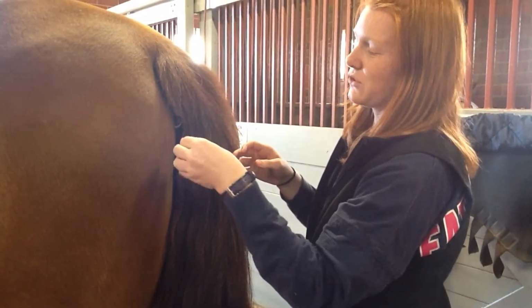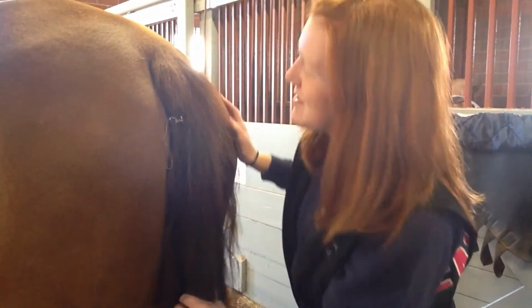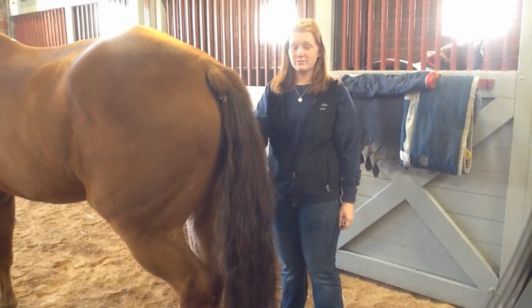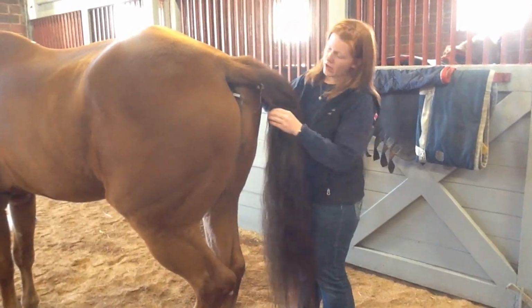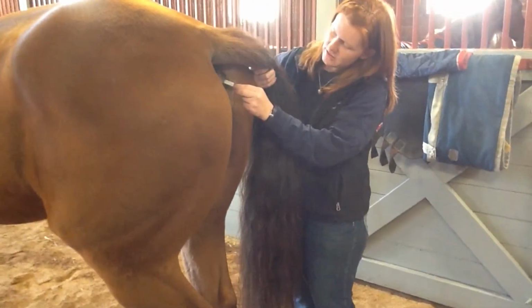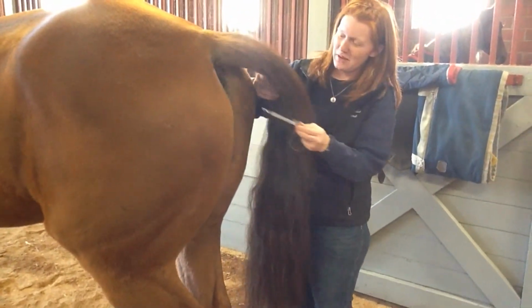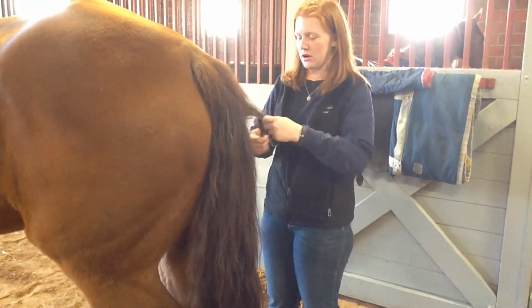Then we're just going to let it sit there for 2 minutes. Timer, can you start my time for 2 minutes, please? Go. Okay, now that our 2 minutes has passed, I'm going to take our thermometer out. Just going to move this tail to the side and unclip it. It is still inserted, so I'm just going to pull it out. I'm going to take some of his hair and wipe it off.